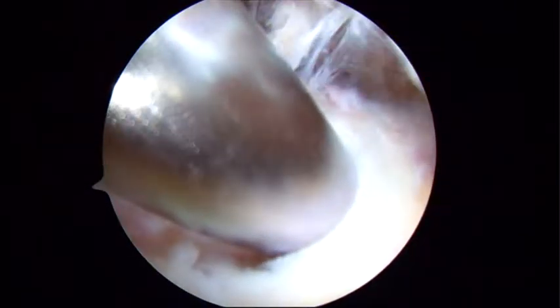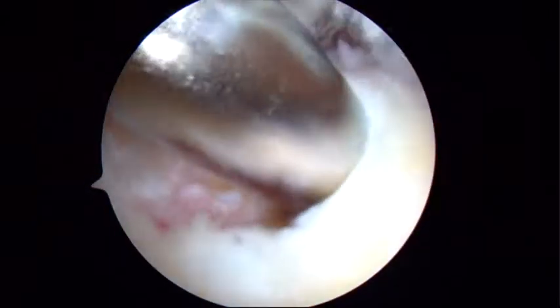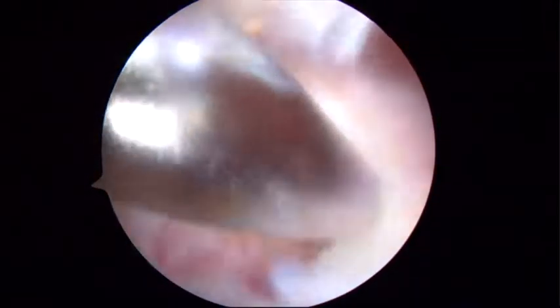And then to debride any devitalized portions of the tendon with a shaver, just so we know what's viable. I think stem cells are very important for healing, so I do debride the tuberosity with a burr just a little bit to a bleeding cortical surface, just until I get some cells to start coming out of that tuberosity, which is where most of the healing occurs.